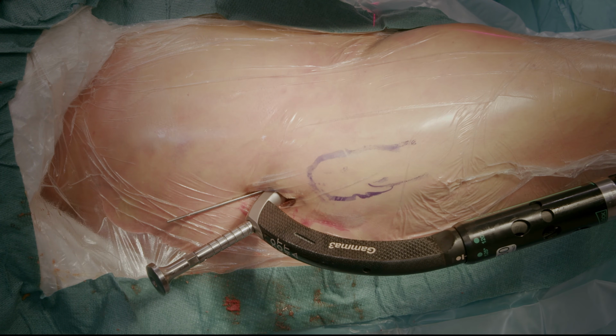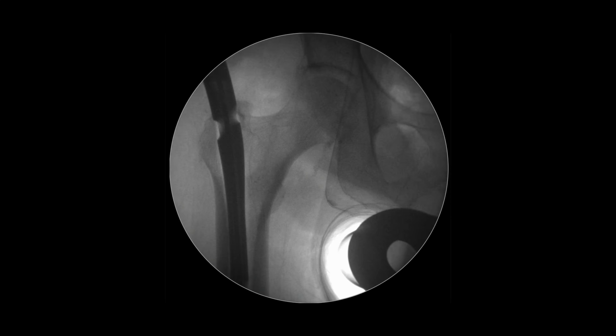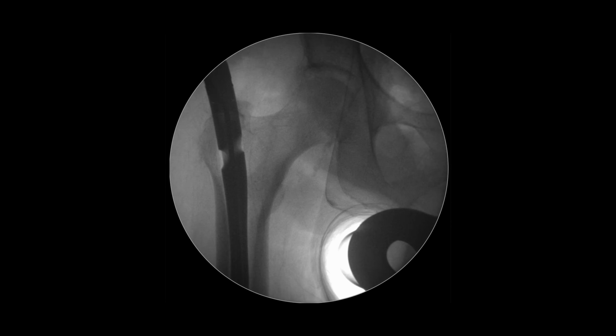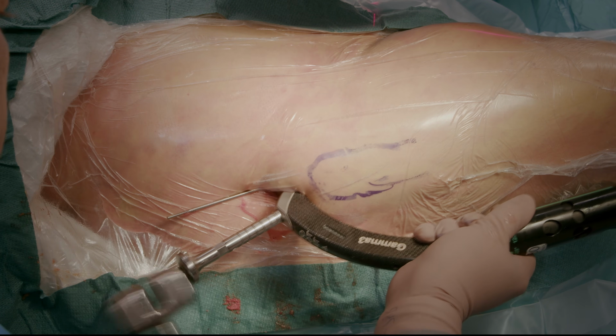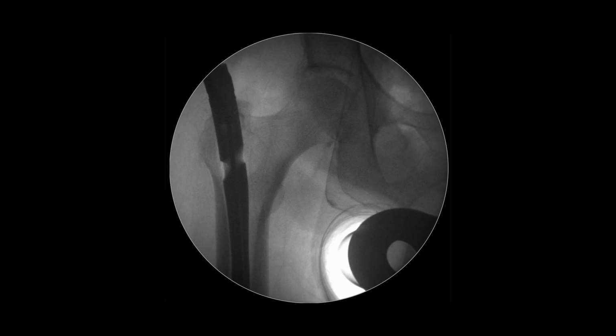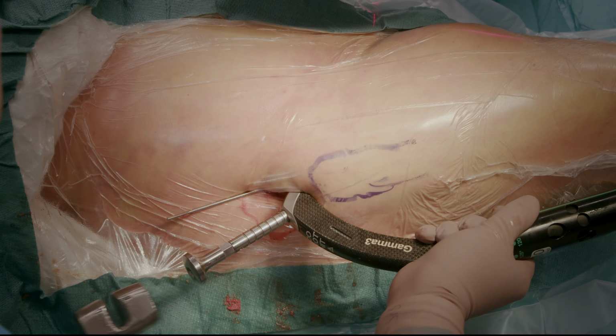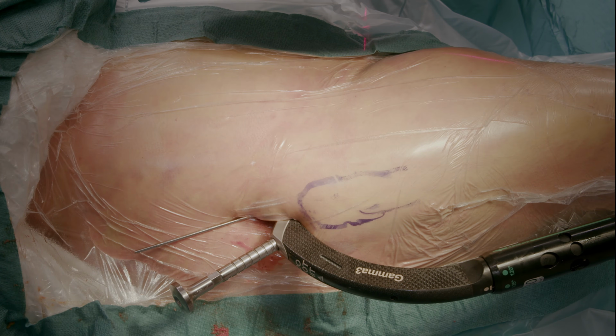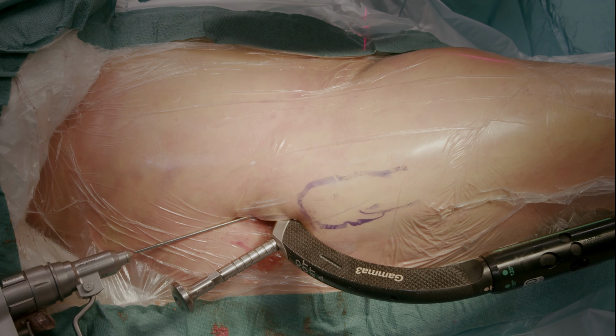Using fluoroscopy, check that the nail starts advancing and has reached the right depth. Before final adjustment of the correct nail position, the guide wire is removed.